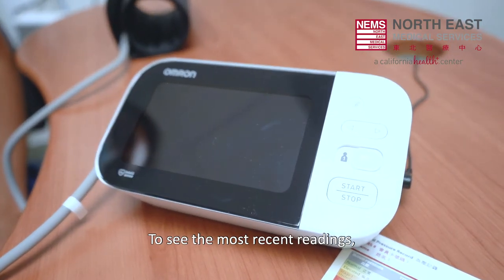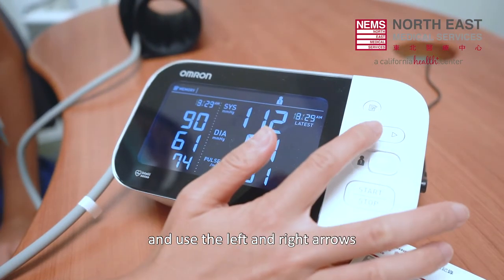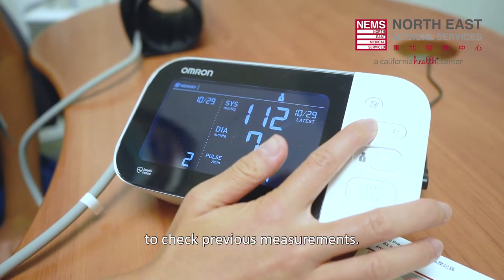To see the most recent readings, tap the note button on the upper right side of the screen and use the left and right arrows to check previous measurements.